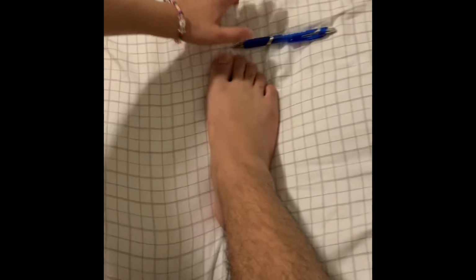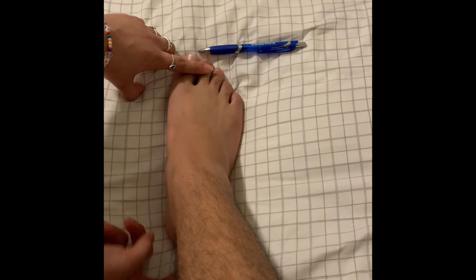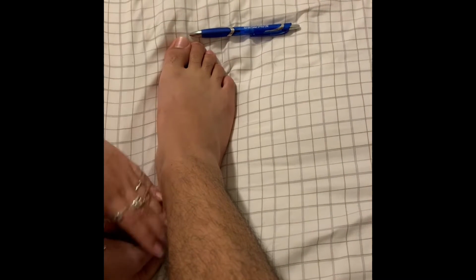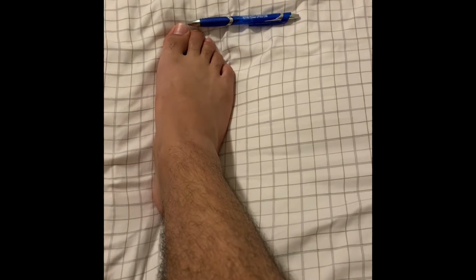Now we have to make sure that the collimation on the machine is long enough so that his toes and his heel are on the picture. Because if it's cut off, either the toes or the heel, you have to retake it again. And you do not want to do that because that means more exposure to the patient.